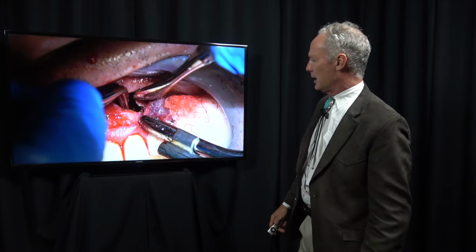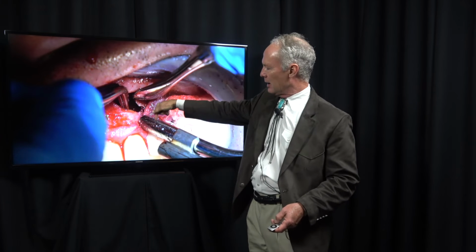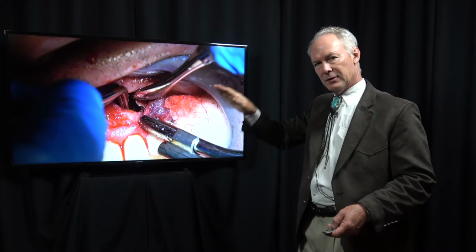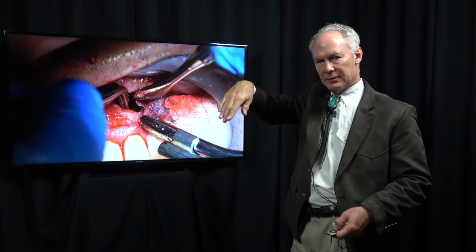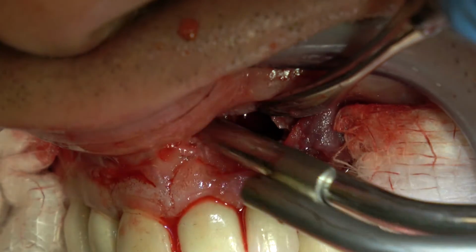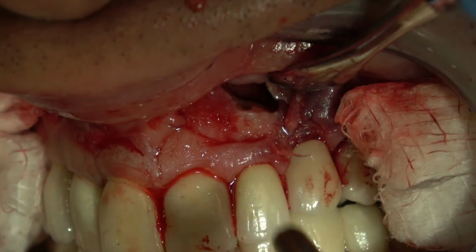But you can see why it's easier to place the retrofill to cut the hole with a beveled cut on the root of the tooth than a perpendicular cut. This one has gotten a little more perpendicular just because I had to remove more root structure on the palatal part.